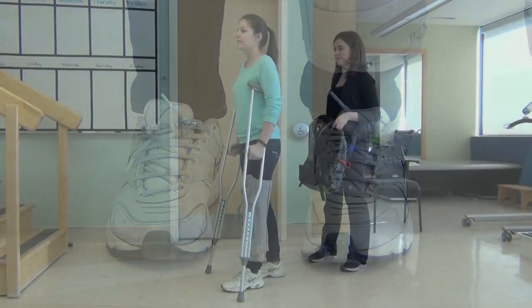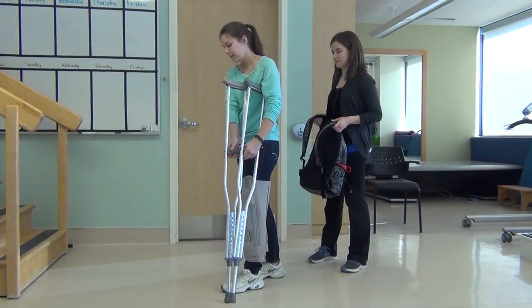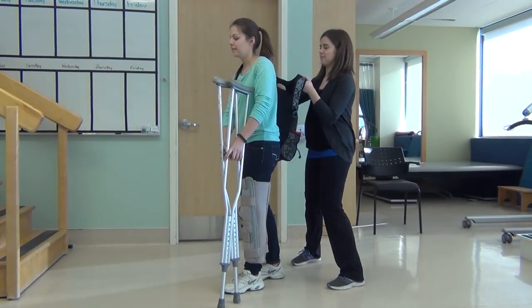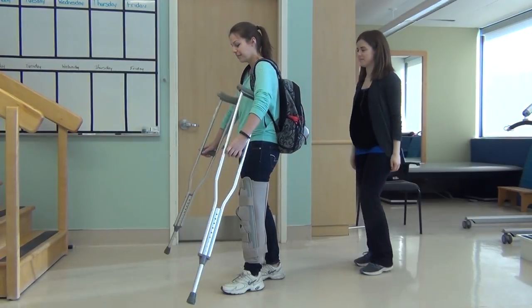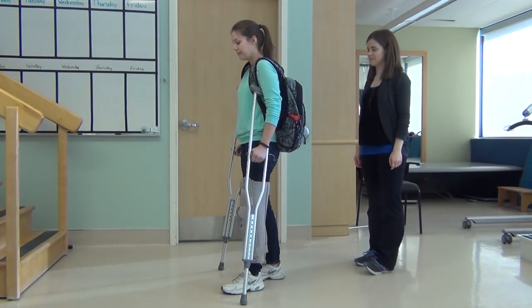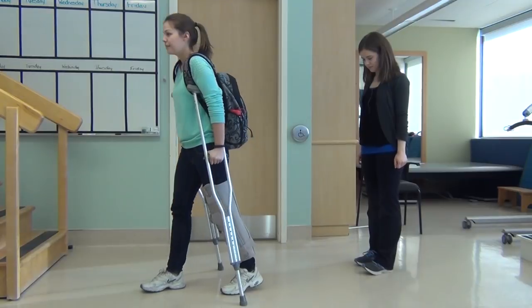Wear well-fitting low heel shoes. Use a backpack to keep your hands free while walking. Make sure that the bag straps are over both shoulders so you maintain balance. If you have a shoulder bag, wear it across your body so you don't fall to one side. An adult can help you put on your bag.